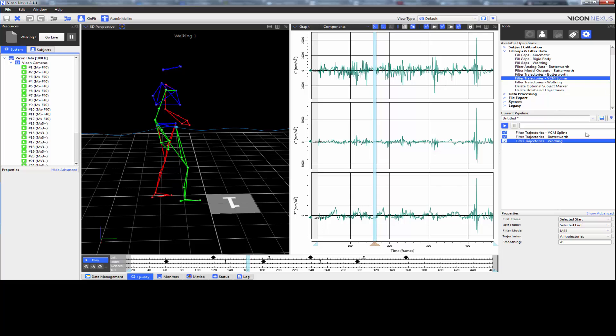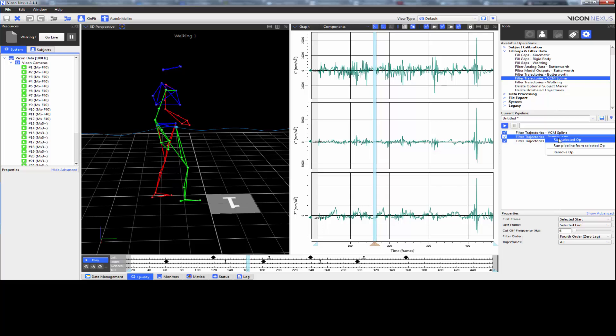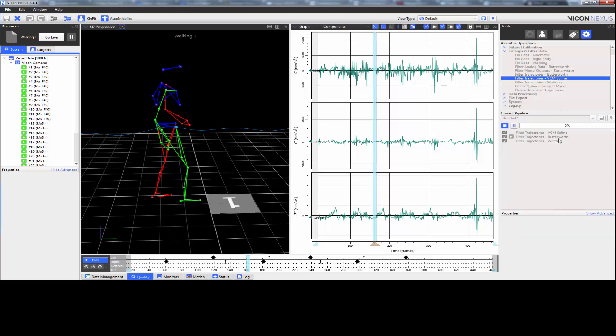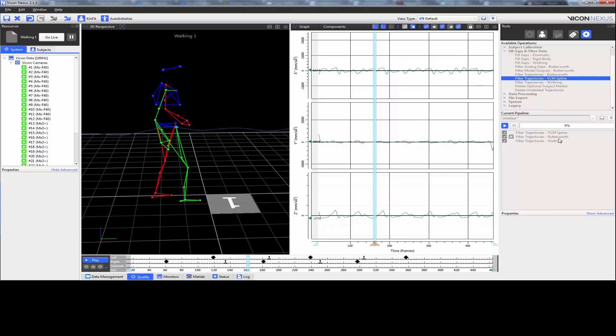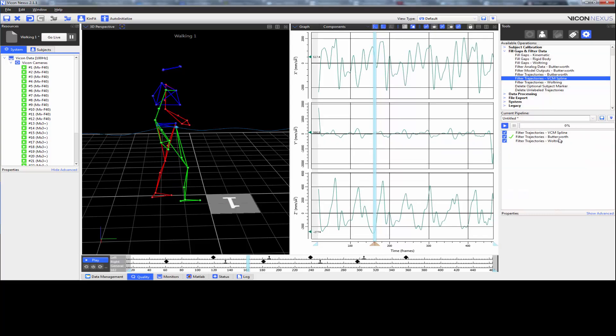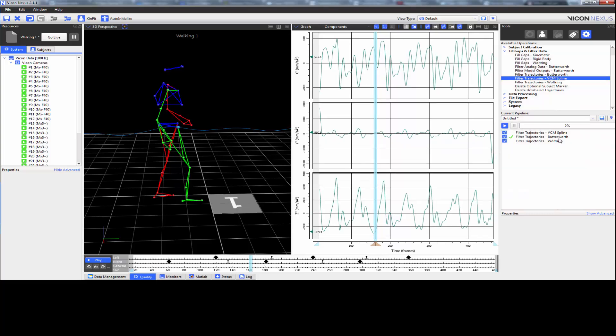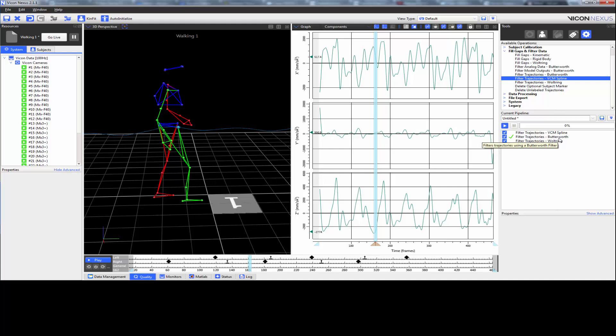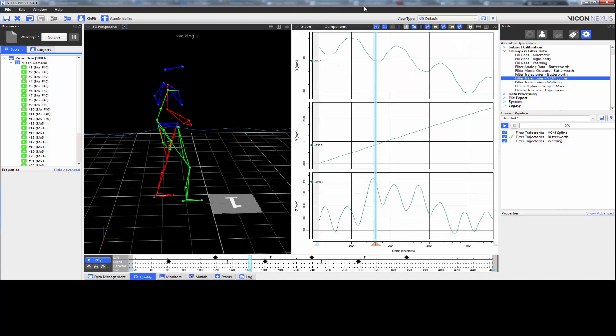In this example, I'm going to use the Butterworth filter, which is set to 6 Hz. When I run this, we can now see that the acceleration data is nice and smooth. Don't forget to change it back to the displacement.